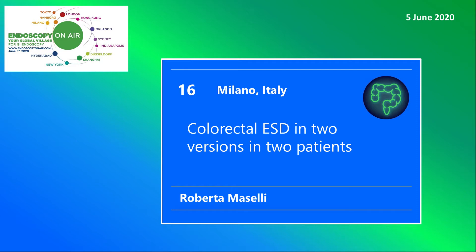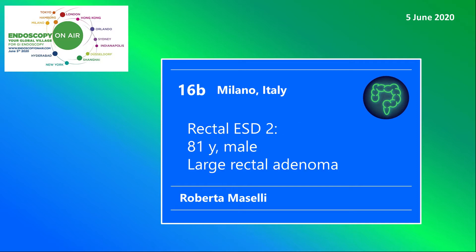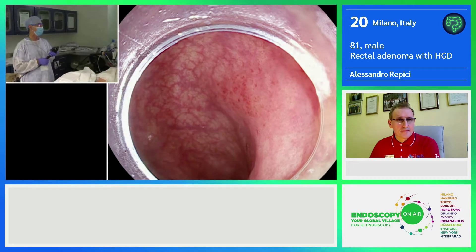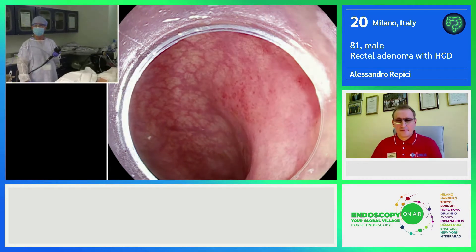Welcome to Endoscopy on Air 2020. Watch Roberta Mazzelli performing colorectal ESD in two subsequent patients. This is now patient 2, an 81-year-old male with a large and suspicious rectal adenoma. We are using the latest generation Pentax scope.